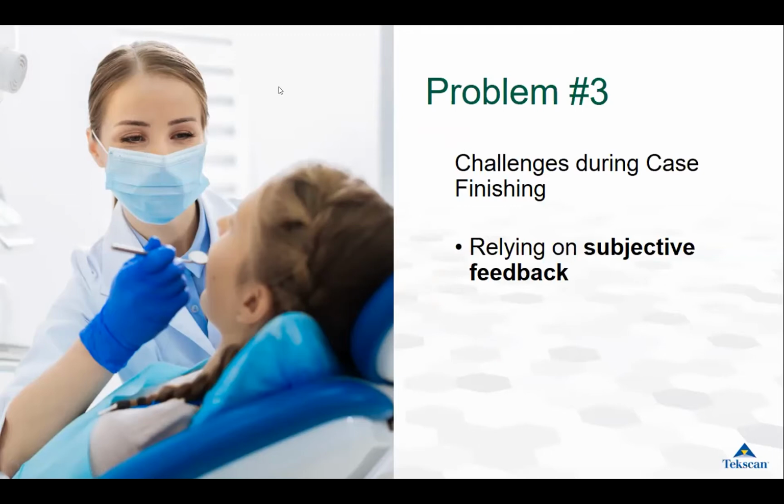And we have another poll that we would like to ask of, now that we've reviewed these three problems of case finishing, patients with repeat visits and using articulating paper alone, have you experienced any of these problems in your practice?